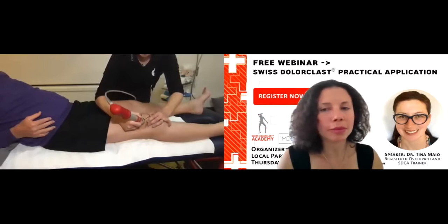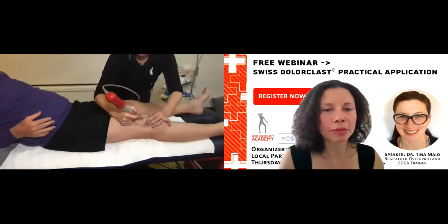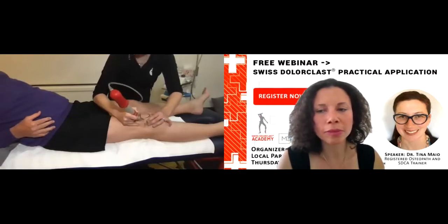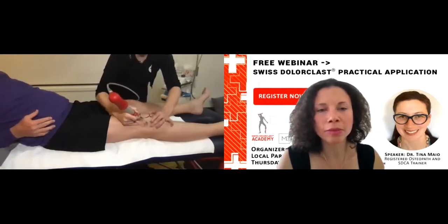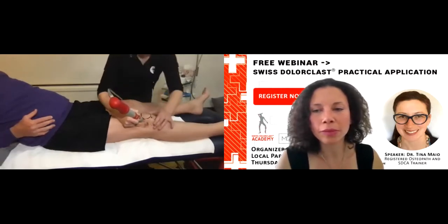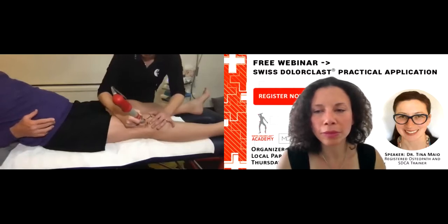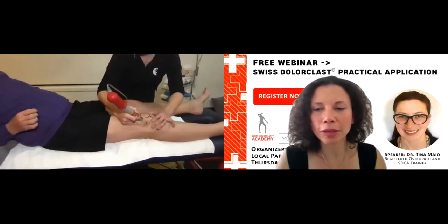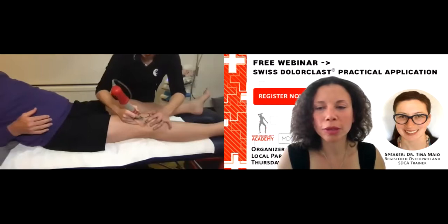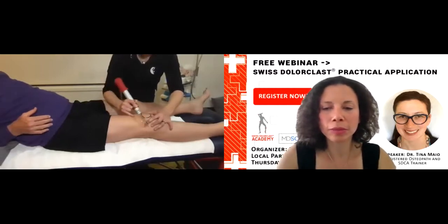So if this was a clock, think of going from 12 o'clock to 3 o'clock. Work around the top quarter of that patella. Okay? It's no pain. Good. So out of 10, that's all right? 3. That's okay, excellent. And now? That's already eased off. If you were on the actual bone, yep. And once you get into the tendon itself, it's fine. Less painful. Yep, great. So I'm going to go medial now.